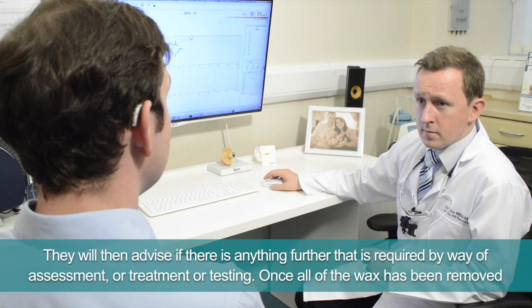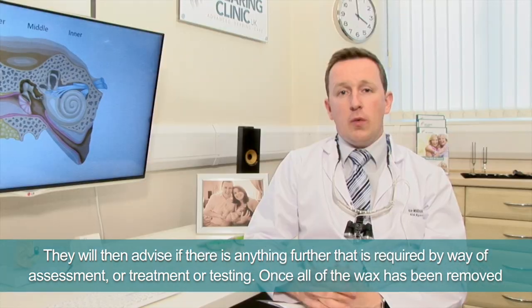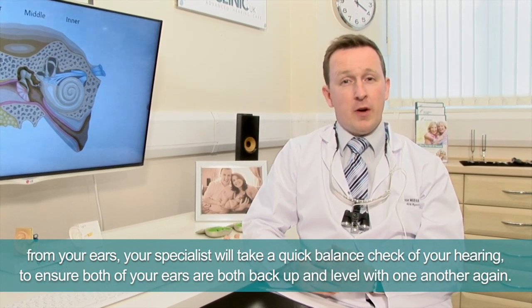They will then advise if there's anything further required by way of assessment, treatment, or testing. Once all of the wax has been removed, your specialist will take a quick balance check of your hearing to ensure that both ears are back up and level with one another again.